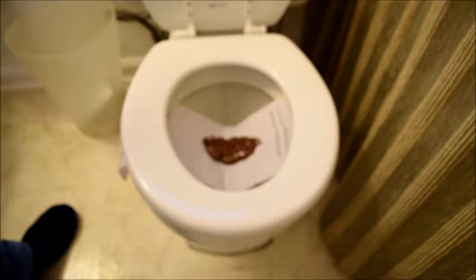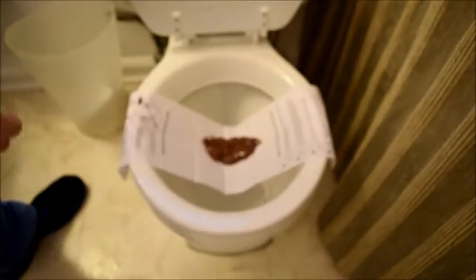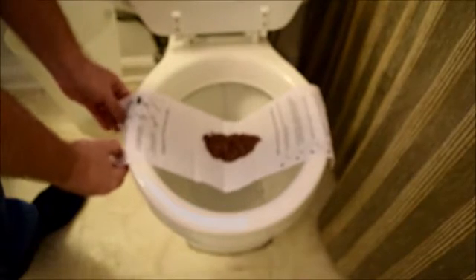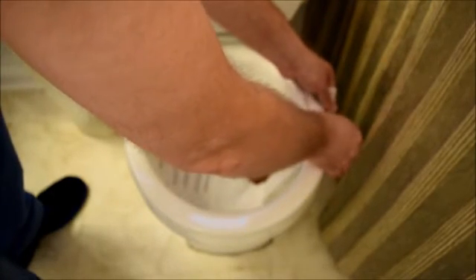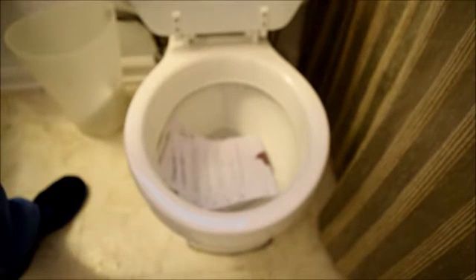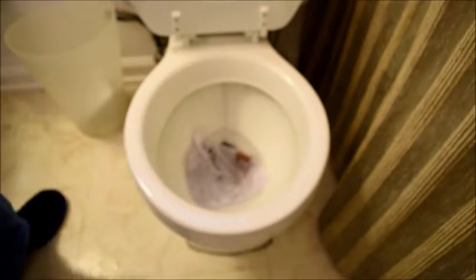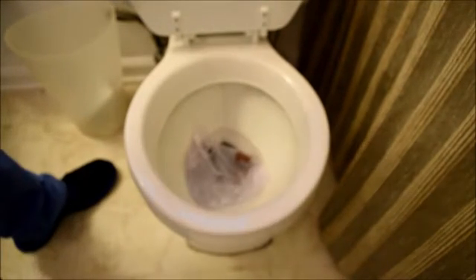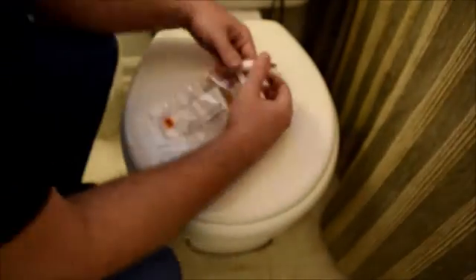Now that you've finished your collection and your sample is in the collection tube, it's time to go ahead and get ready to dispose of your stool. Go ahead and lift the toilet seat, remove the adhesive strips from the side of your toilet bowl, and let the paper fall into the toilet bowl. This is flushable tissue paper. It is degradable. It will not harm your septic tank, and it will not clog your plumbing. I'm going to let the tissue paper sit in the bowl for a moment while I put the sample into the collection bag. Go ahead and put the lid down.